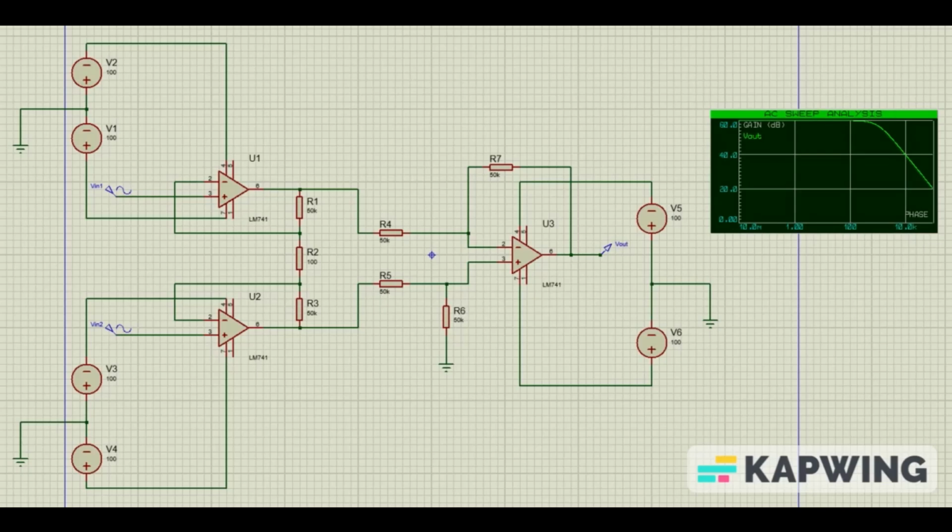Most ECG signals need a gain of at least 100 decibels. A circuit's gain is measured in decibels and is equal to 20 times the logarithm of the output voltage divided by the input voltage, as was mentioned earlier. So we can calculate the ratio of output to input voltage in terms of resistive components by using nodal analysis. For our circuit, this leads to a new gain formula that includes components from both the band-pass filter and the amplifier. So in order to achieve a gain of 100 decibels, we need to select appropriate values for the resistor and feedback resistor components of the amplifier.